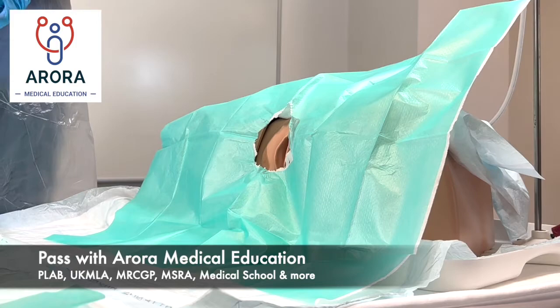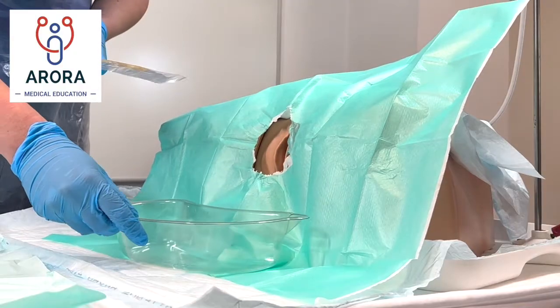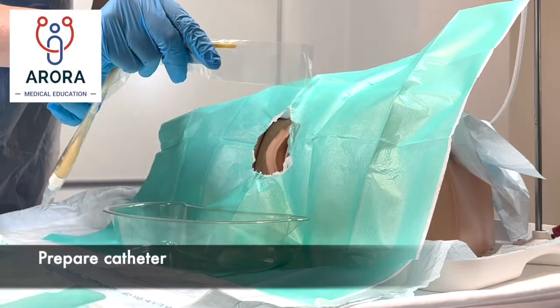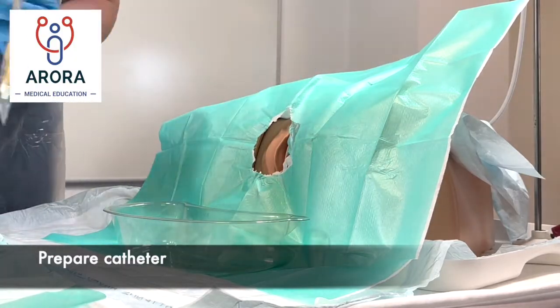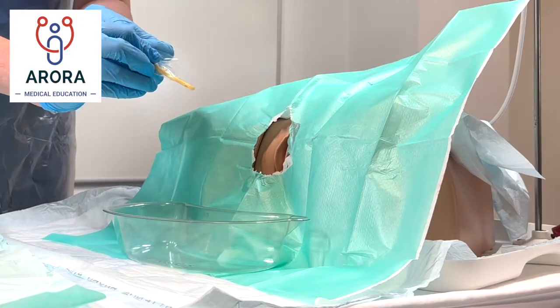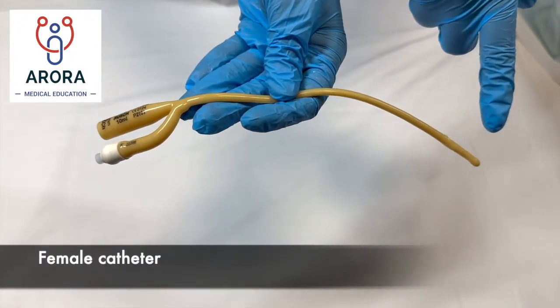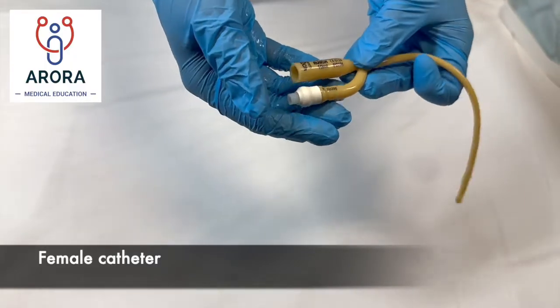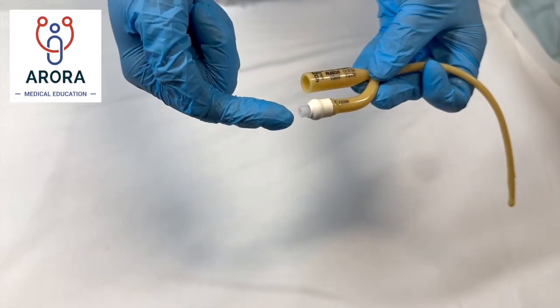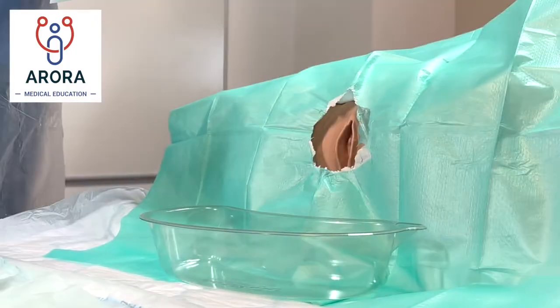Once we've given the anesthetic gel some time to work, we're going to get the catheter ready and the tray to collect any urine. The catheter will come with a tear-away piece of plastic — release that into the bin so we can avoid touching the tip with our hand. The end which inserts into the bladder goes in first; the other two ends — one drains the urine, and one is for inserting the syringe of water to inflate the balloon. The size of the catheter is written on the packaging.